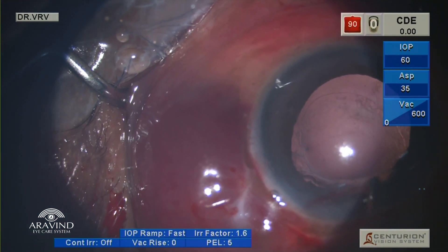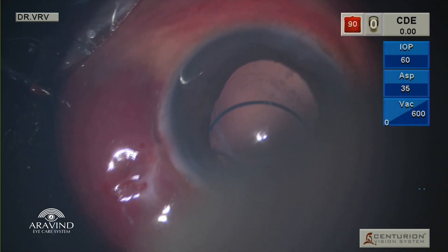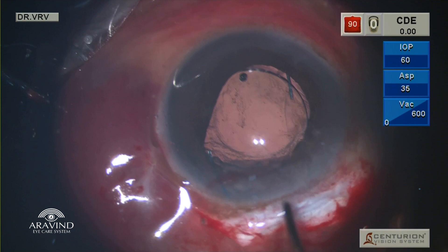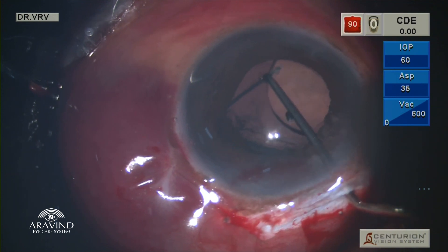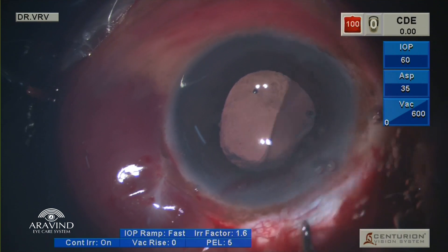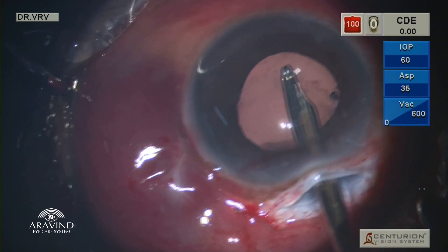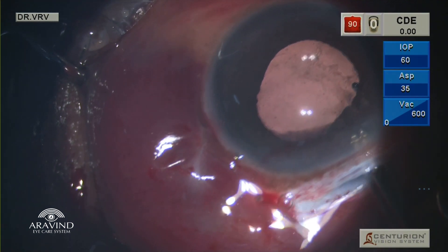Following which, viscoelastic is injected into the eye. We decided to place a three-piece PMMA lens in the sulcus for better stability. The leading haptic is placed in the sulcus, following which the trailing optic-haptic junction is held with the Sinski and then dialed into the sulcus area. Once the IOL is stable, the viscoelastic in the anterior chamber is flushed with BSS using a Simcoe cannula.